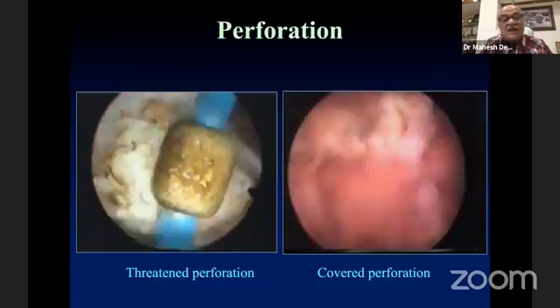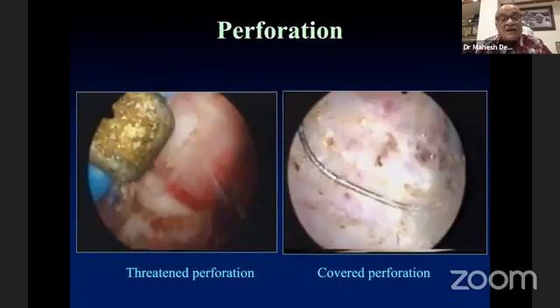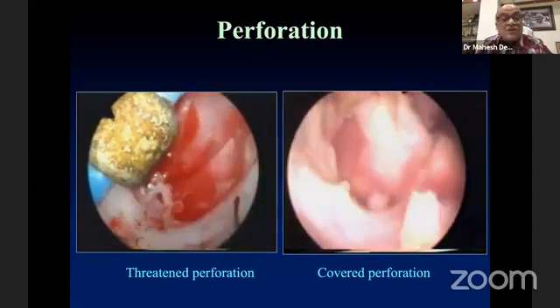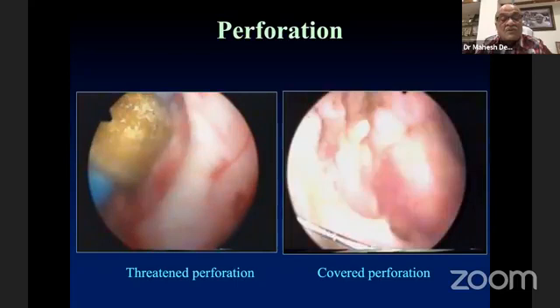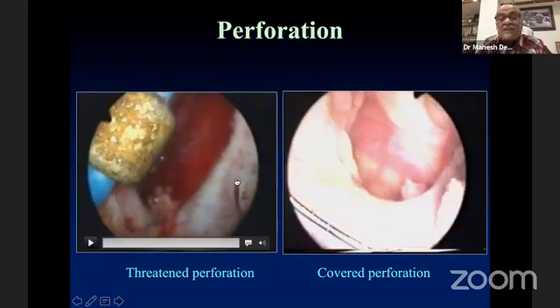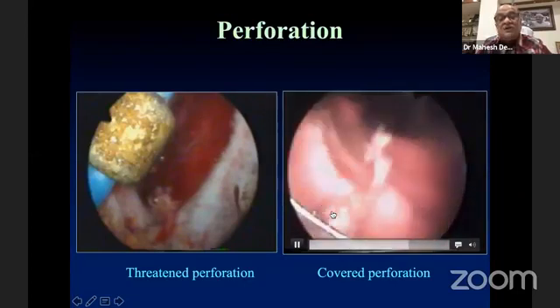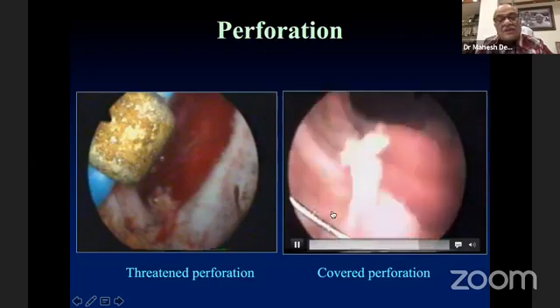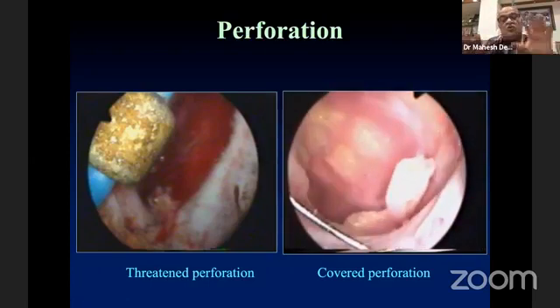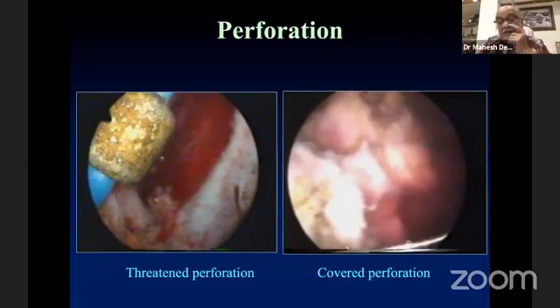And sometimes while doing this, earlier we used to see perforation because at that time our experience was less. The idea was don't go directly to the capsule, but go by the side and coagulate by the side or press it, so the vessels feeding into the perforation will stop. Always make sure that there is water absorption going on. You make sure that it is controlled. So if it is identified and controlled, there is less chance of bleeding there.